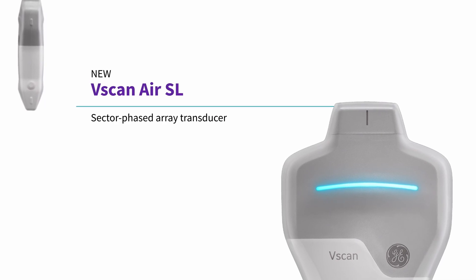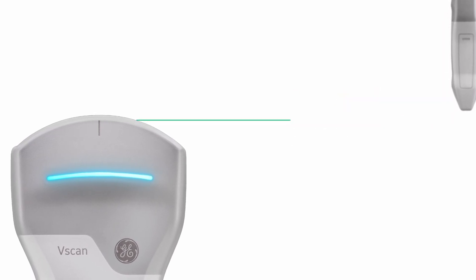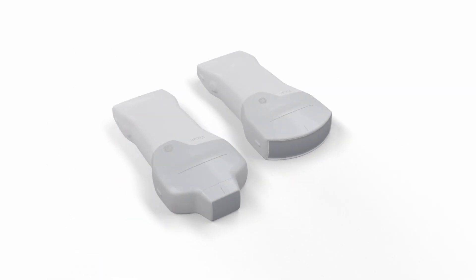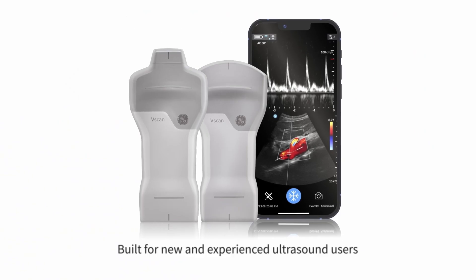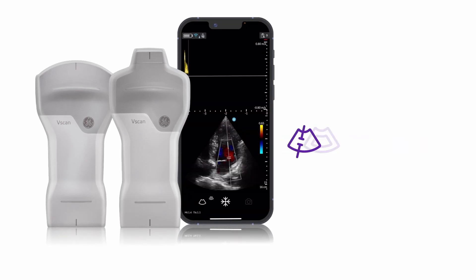Next, the GE VScan Air SL. This one's for those of you who hate wires, which, let's be honest, is all of us. It's wireless and gives crystal clear images for different scans. It's got a dual probe design, so it's like having two ultrasound machines in one, which sounds both practical and slightly greedy. It's also great for dramatically throwing your probe on the table after a successful scan, in true doctor show fashion.